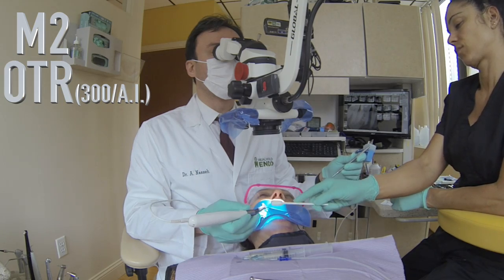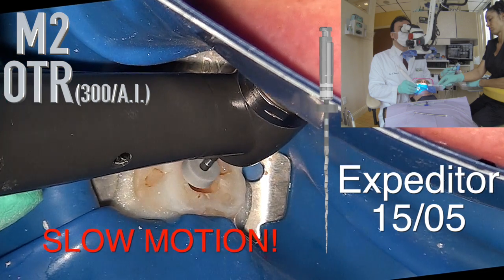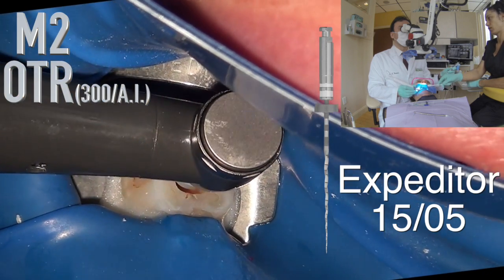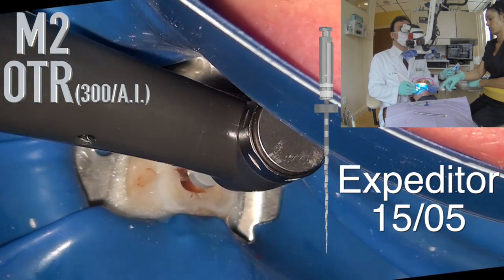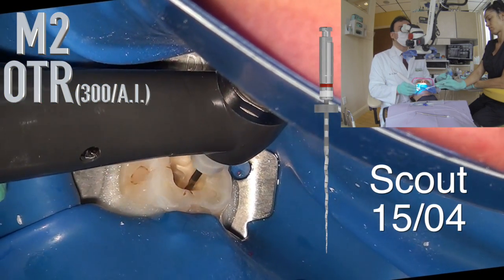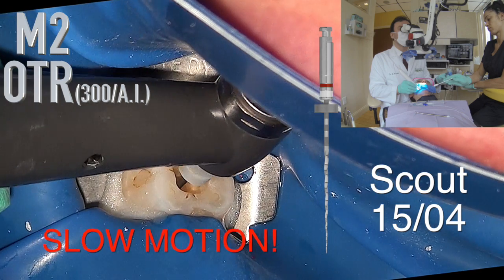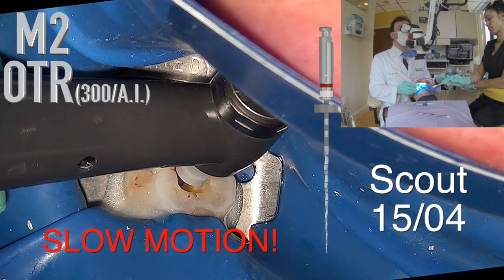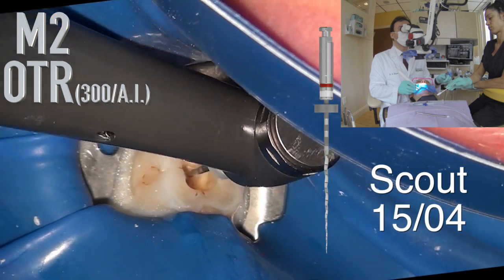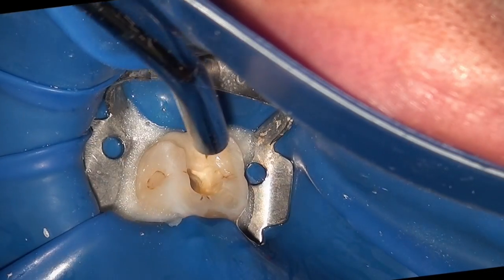So now we've moved on to this hybridization of taper, moving down. We use Memory 2 (M2) which has been programmed for 300 rpm using OTR. You can see here in slow motion what's happening with the OTR: on the downstroke, as soon as you engage the file to the level of the torque setting, it starts to engage the OTR motion — which is basically 90 degrees counterclockwise and 180 degrees clockwise. At this point I'm using Canal Clean, which has EDTA in it. Now we've moved from 1505 to 1504 and you can see again in slow motion how the OTR is being engaged, working the file down in each of the four canals. The Endosync is connected to the Endosync AI.